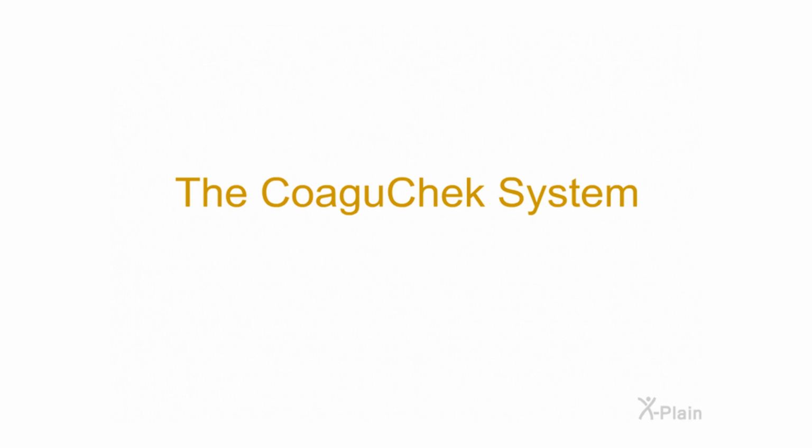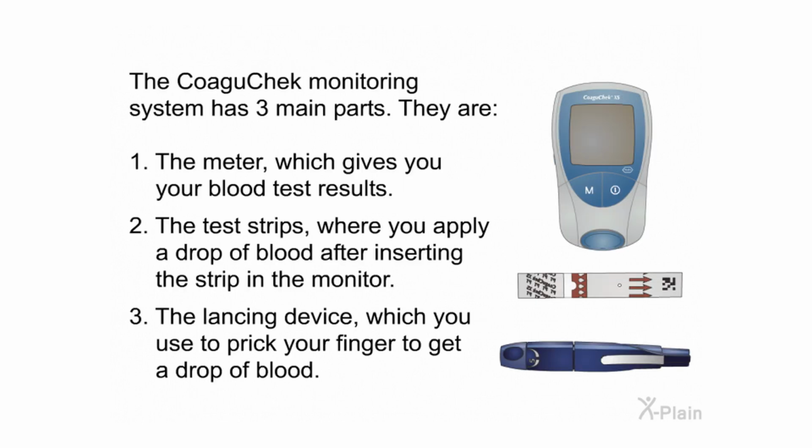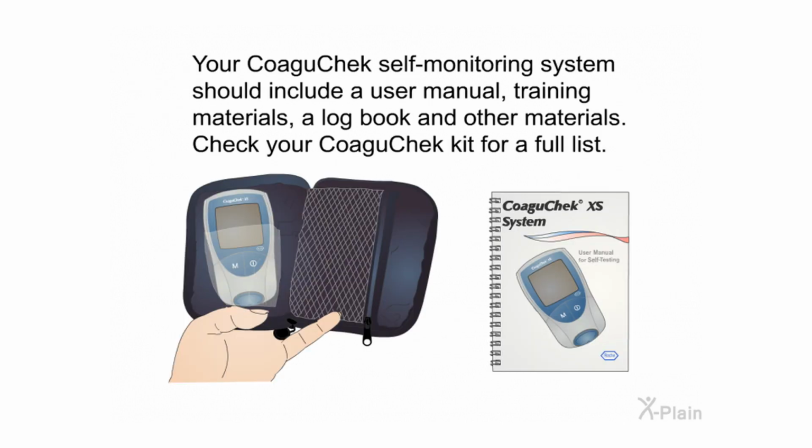The CoaguChek System. The CoaguChek monitoring system has three main parts. They are: 1. The meter, which gives you your blood test results. 2. The test strips, where you apply a drop of blood after inserting the strip in the monitor. 3. The lancing device, which you use to prick your finger to get a drop of blood. Your CoaguChek self-monitoring system should include a user manual, training materials, a logbook, and other materials. Check your CoaguChek kit for a full list.